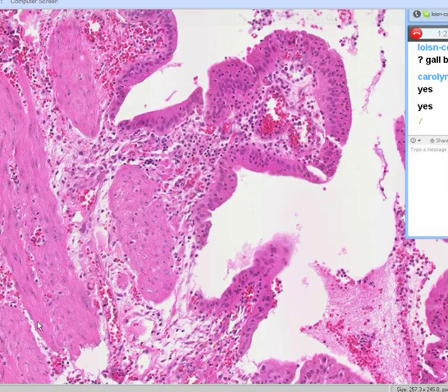Carolyn, what do you call it when you have neutrophils infiltrating the gallbladder wall? Neutrophils and it's colo... You're close. Inflammation of the colon? Look, lithiasis. You're close. Colon, acute. Acute cholecystitis. Okay, that's right. Acute cholecystitis. So what would be one of the most feared consequences of acute cholecystitis?